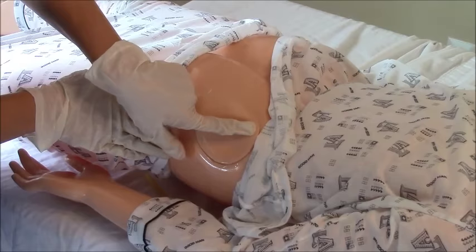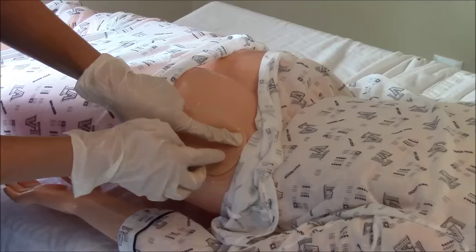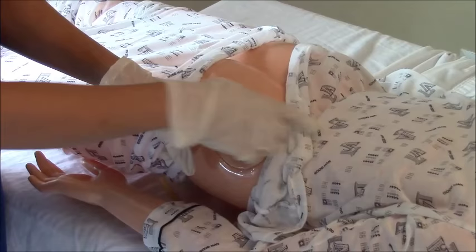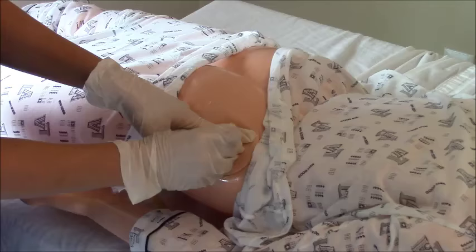After you have your imaginary line drawn, you're going to place your finger above it where your line would be and go above that line. The reason you want to go above that line is because in this region right here the sciatic nerve runs, so you do not want to hit that. So we have our landmarks and we have where we want to go.